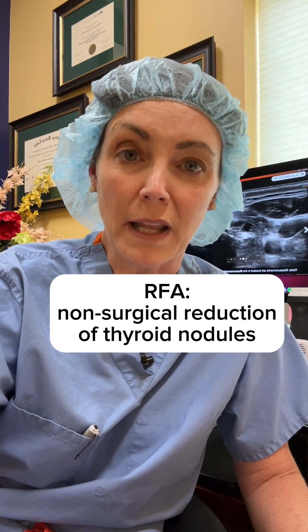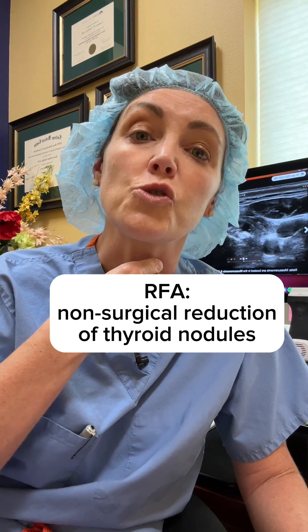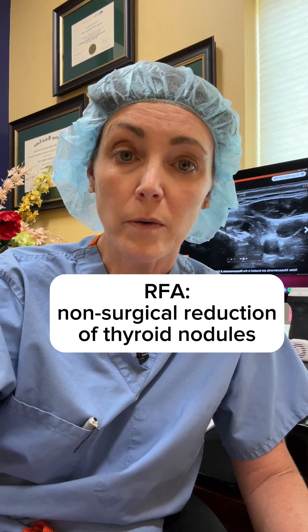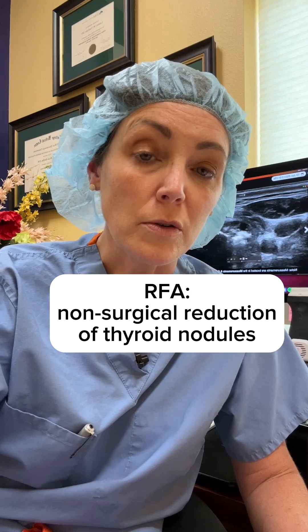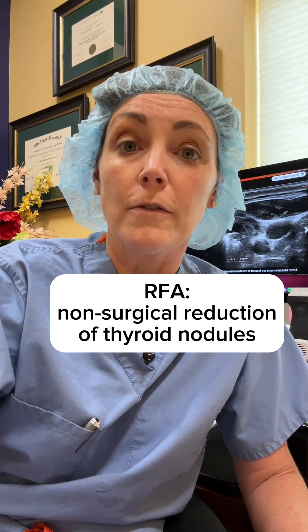Dr. Van Dyke here. We just got done doing a radiofrequency ablation of a thyroid nodule for a patient who was having obstruction — she couldn't swallow very well. What I'm going to show you is how RFA works to shrink nodules 50 to 80 percent of their original size.